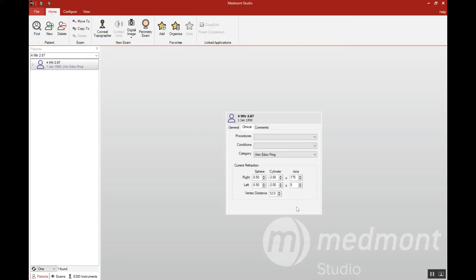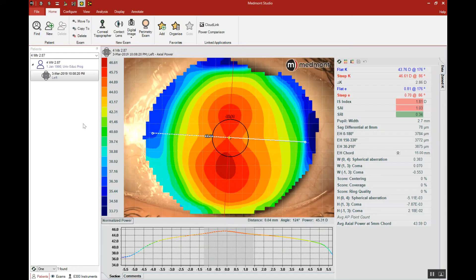This will ensure that when you engage the contact lens software, it will automatically import this Rx and calculate the appropriate lens power. The next step is to ensure that we have a good quality capture to build our lens from.